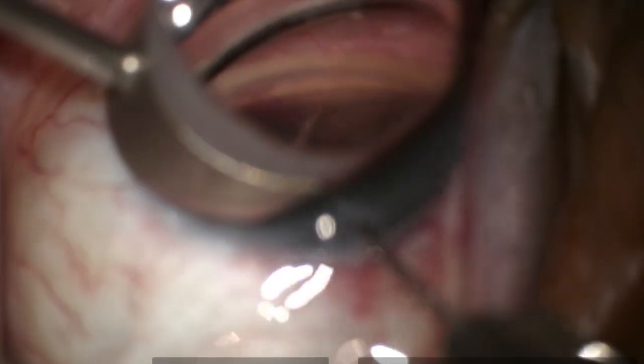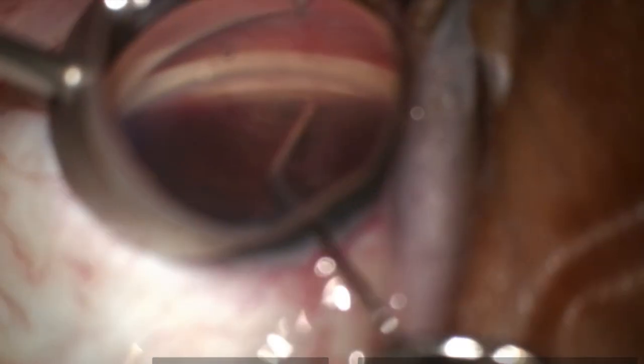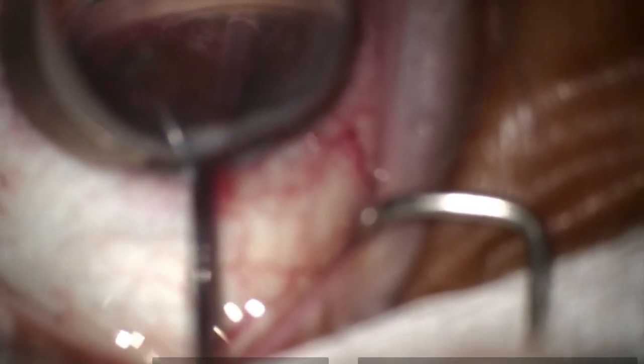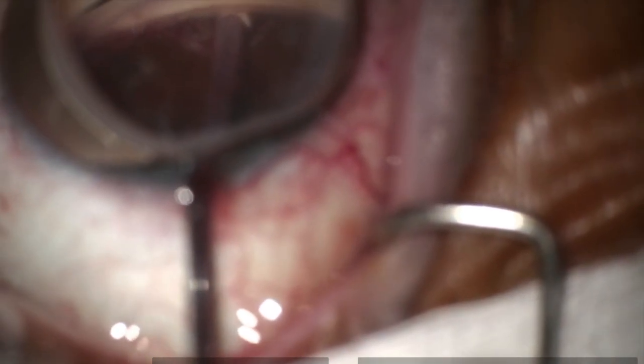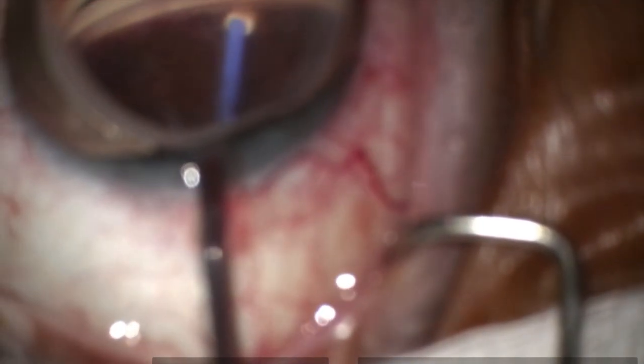Heme becomes clinically significant when it prevents visualization of landmarks needed for safe implantation. The key principle is simple: restore visualization before continuing. Effective heme management keeps the procedure controlled, predictable, and safe.